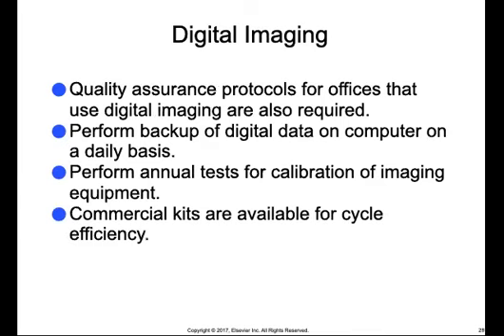Digital imaging requires quality assurance protocols as well. This will usually include performing a backup of digital data on the computer on a daily basis so that we don't lose any of our previous patients' films. We'll also want to perform annual tests for calibration of imaging equipment, and there are commercial kits available for this.